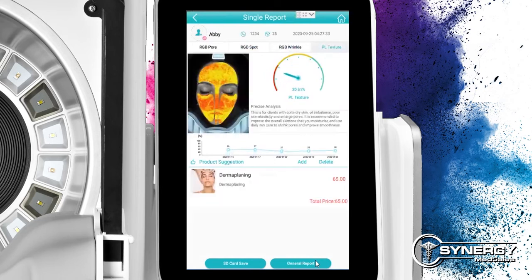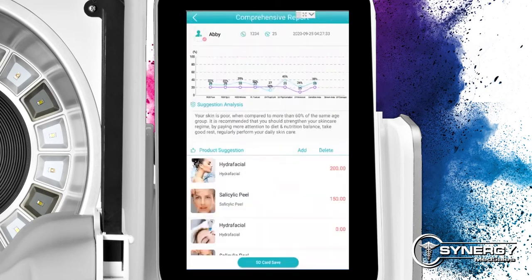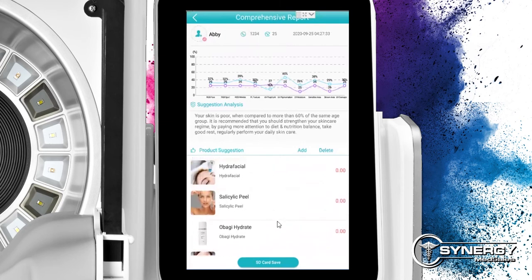You'll also start to notice on the bottom, as I tab through, your products and services will start to be recommended. So you do customize this; your products and services are loaded. Based on its findings, it's going to recommend, per skin condition, what you offer to treat it. I'm gonna go into general report, and now in general report, it's all the products and services compiled into one list, as well as a line graph. On our line graph, what it's telling us is her skin age and her percentile per skin condition.